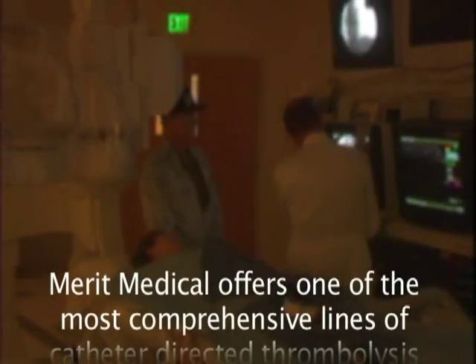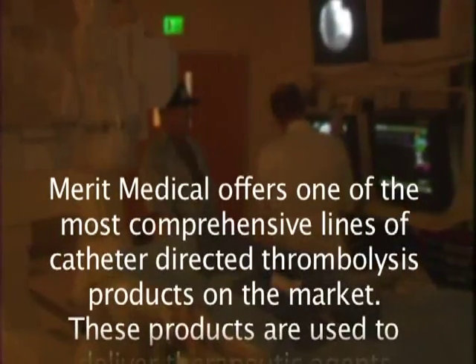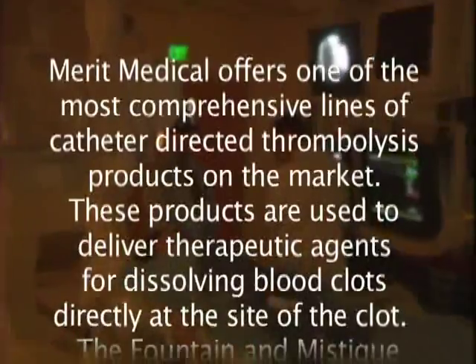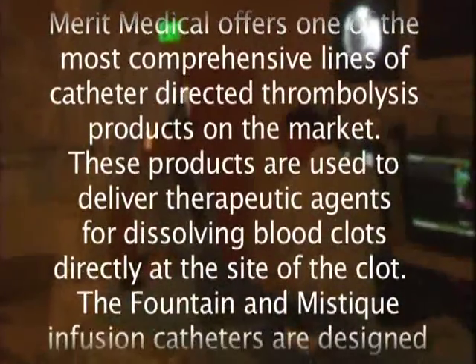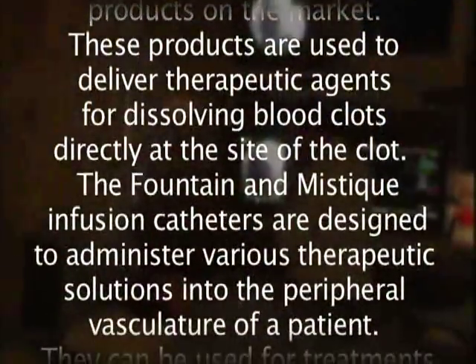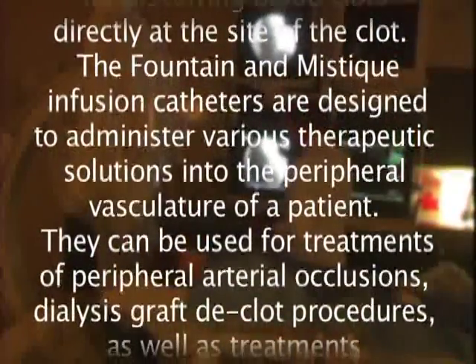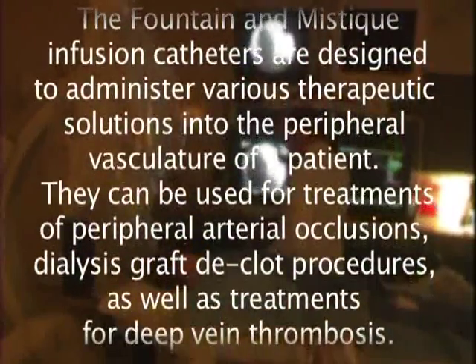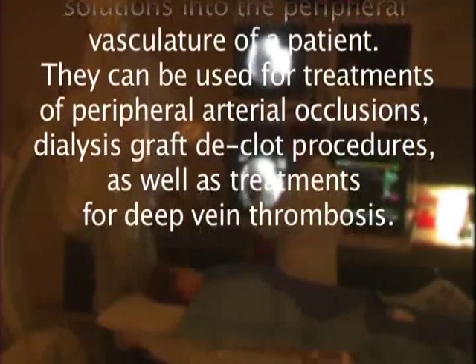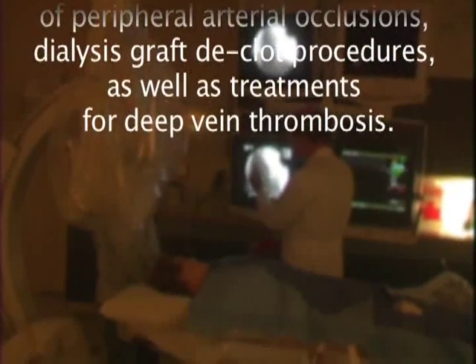Merit Medical offers one of the most comprehensive lines of catheter-directed thrombolysis products on the market. These products are used to deliver therapeutic agents for dissolving blood clots directly at the site of the clot. The Fountain and Mistique infusion catheters are designed to administer various therapeutic solutions into the peripheral vasculature of a patient. They can be used for treatments of peripheral arterial occlusions and dialysis graft-declot procedures, as well as treatments for deep vein thrombosis.